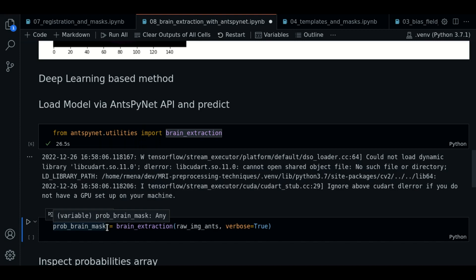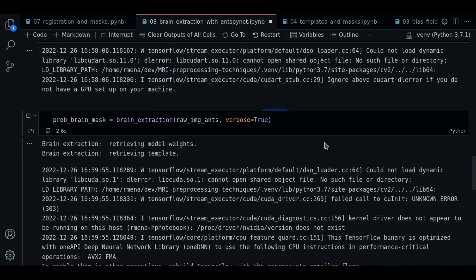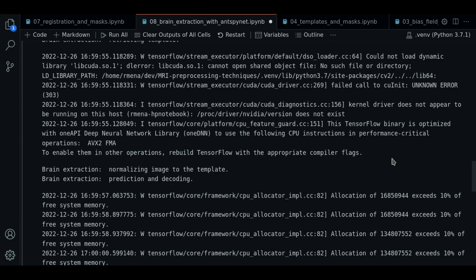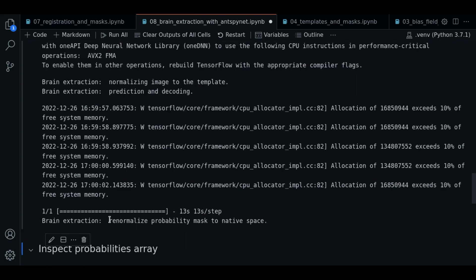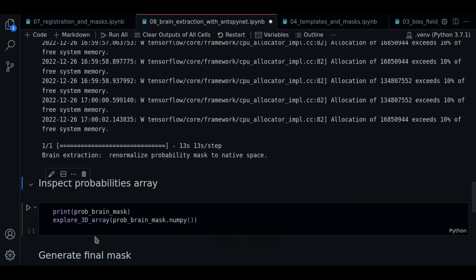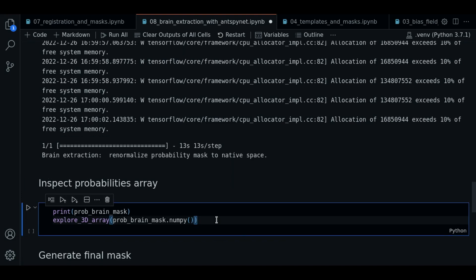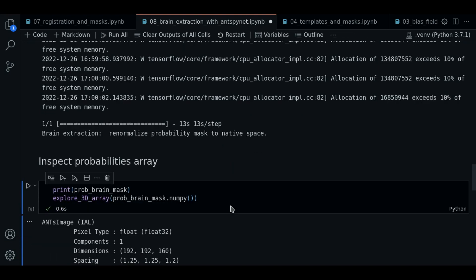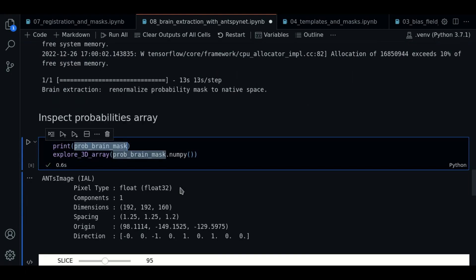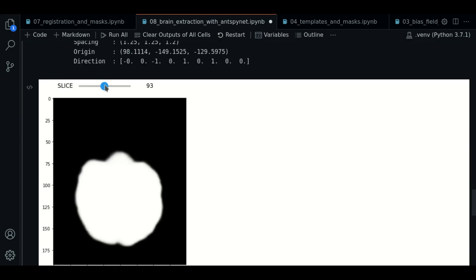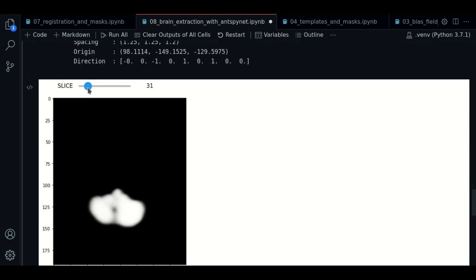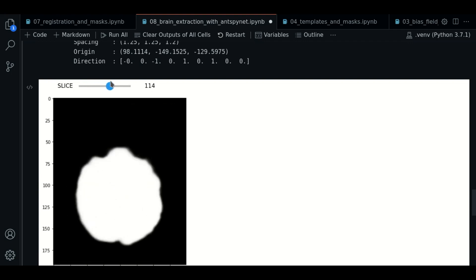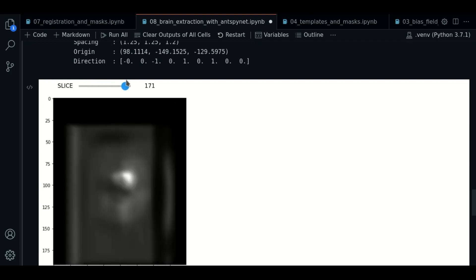Now I'm going to execute the function. I'll speed up the video. This process generates some logs. And now, let's inspect the probabilities generated. We print the variable, and it is pretty much like other ANTSPY image. It has same formation as the original one. We just plot it to see what is inside. This is not the final mask.